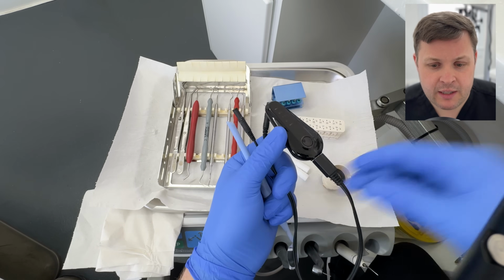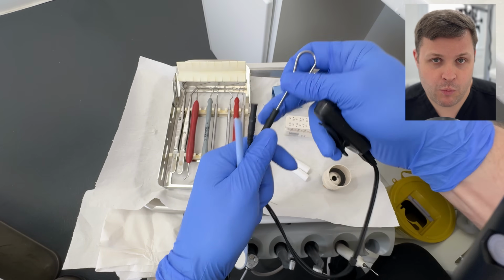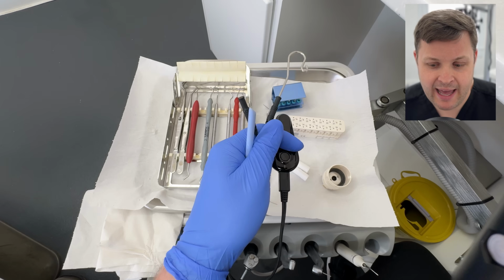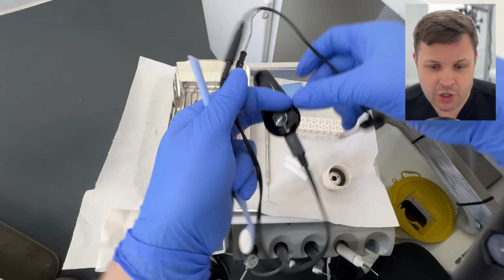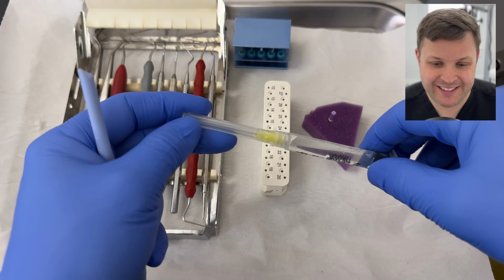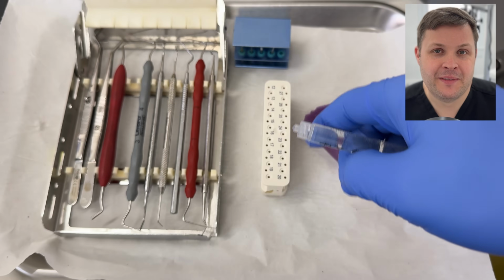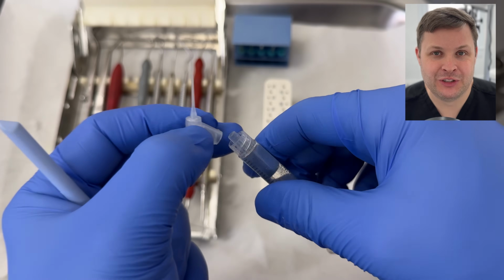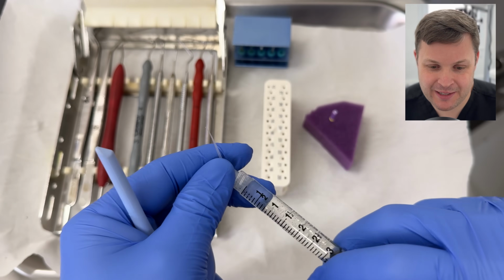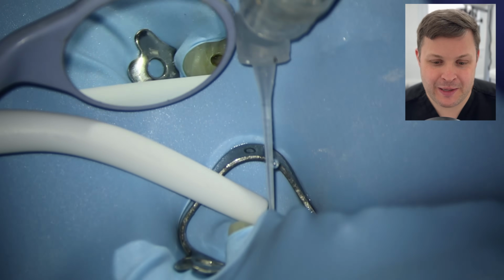Once we've cleaned out the canal space, I think the palatal is pretty wide, so I'm going to pick up my apex locator straight away. You'll notice there's no fancy screen on this because my nurse has broken it. Luckily, with these Wirelex apex locators, the little Bluetooth dongle that sits on there works as an apex locator as well. So I'm in the process of buying a new apex locator.